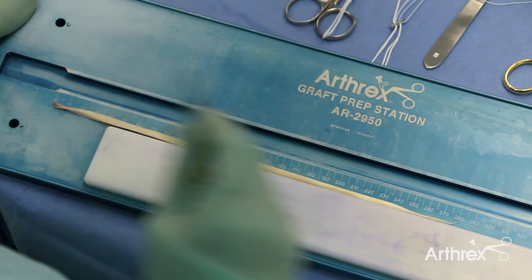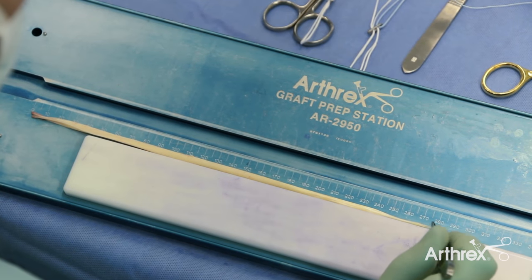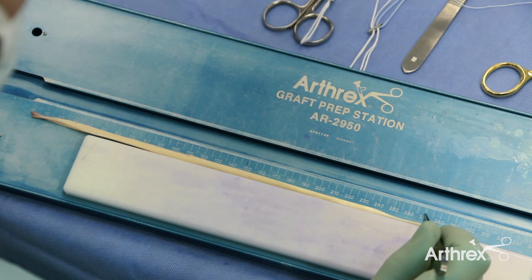As you can see, the graft measures 27 centimeters in length. This can be quadrupled, and with a 27 centimeter graft, this gives between 65 and 70 millimeters in length for the graft link.